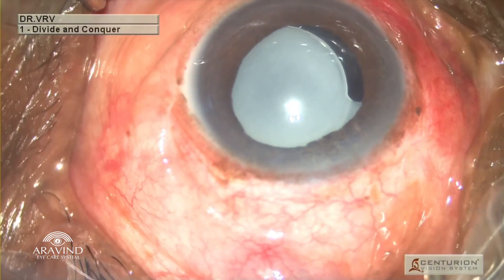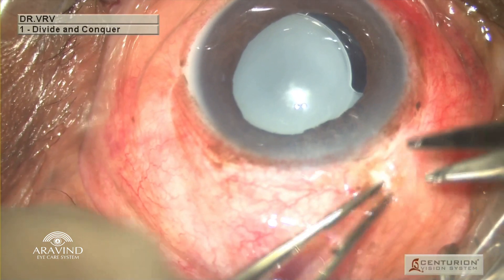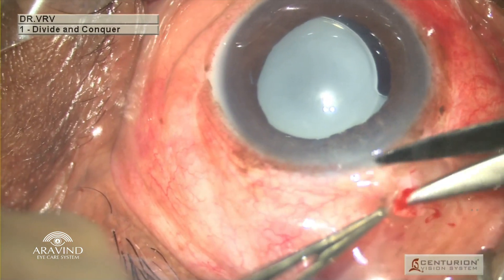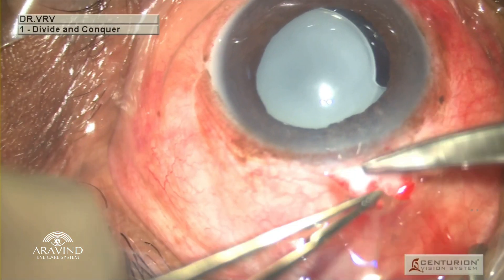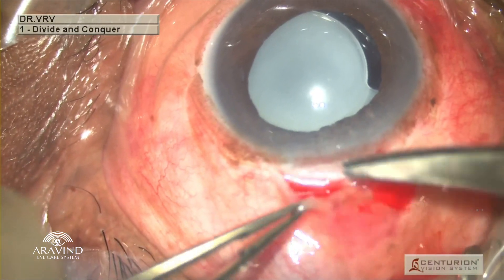The patient had with-the-rule astigmatism of 1.75 diopters, so a superior sclerocorneal tunnel was planned. The superior conjunctiva was a little bit fibrosed and dense at the limbus, and the cornea had a little bit of stromal scarring, suggestive of a manual small incision cataract surgery previously done.